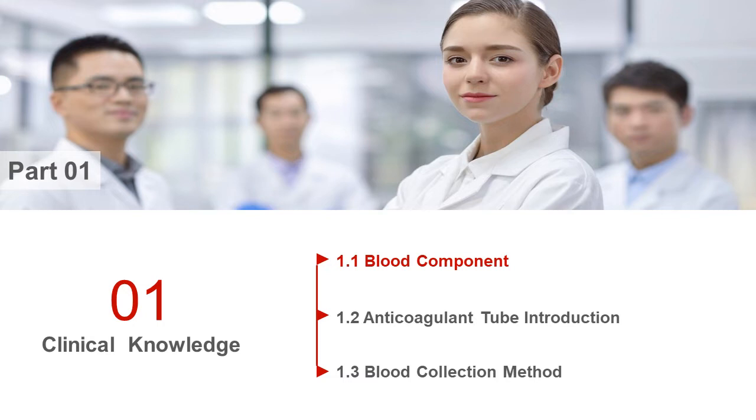Because not all the end users are using control. If they are not using control, we will have some unnecessary calls from the end user. Why? Because they will ask why some result is not matching the other one, and why this machine has the problem. I don't like this machine, and the result is a little low, sometimes it's low. They always challenge our machine just because they don't have QC and they don't have control, then everything is a mess.